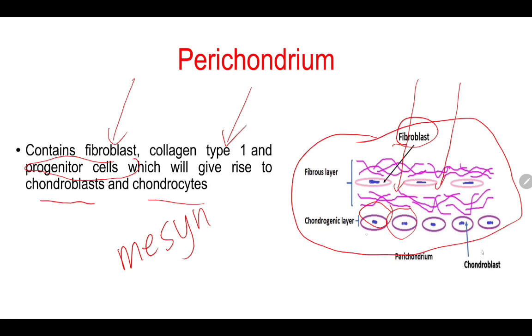made, they will form yung tinatawag natin na chondrogenic layer. This chondrogenic layer is the line of chondroblast. So, pag tinanong kayo, what do you call a formation of line ng chondroblast? So, ang answer natin dyan is chondrogenic layer. So, saan gani makita ang chondrogenic layer? Beneath ng ating perichondrium. Okay? So, please understand yung mga nabanggit.